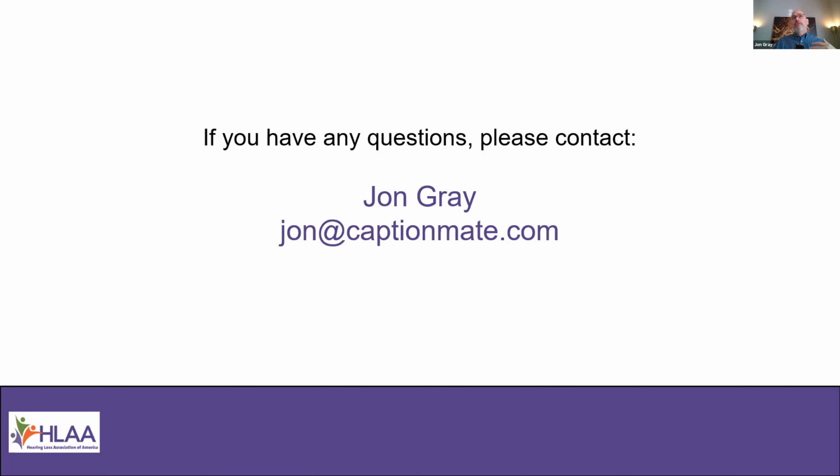IP CTS, this type of service, CaptionMate, is used to make live phone calls. So individuals like myself and you who have hearing loss can read what's being said. And that's what I'm doing on the screen right now. I'm talking and I'm reading. I'm not using it as a translation service because that's not what we do. I'm not using it in a group social setting so I can sit here and read what somebody right next to me is saying. That's not what it's intended for.